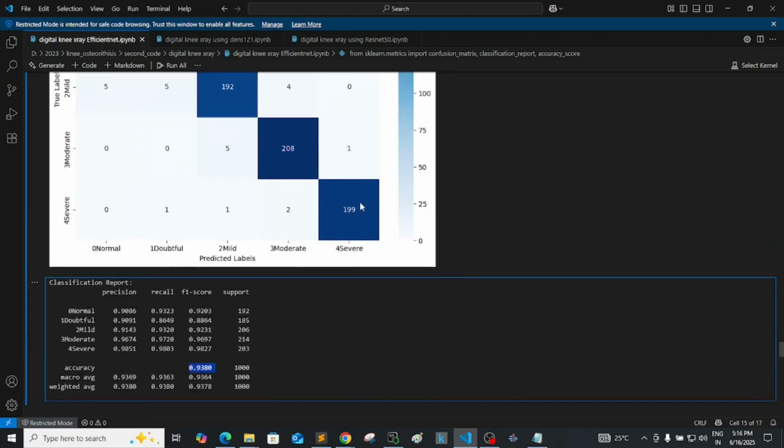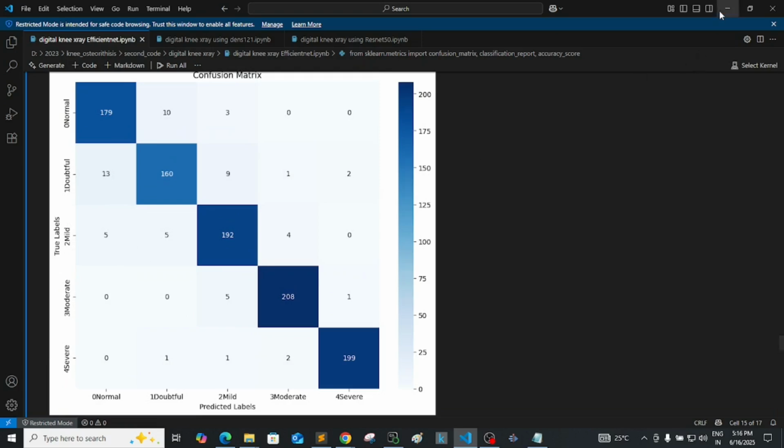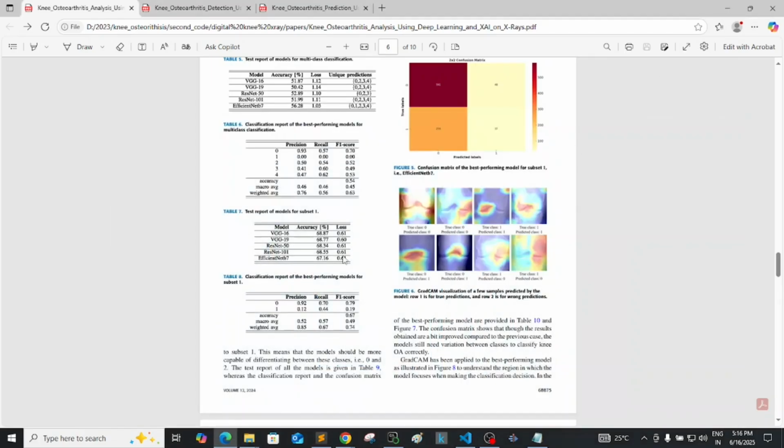We are also using all the 5 classes which that paper is using. So why this sudden reduction in their case? Why are we getting far better results than this paper? What extra are we doing? All those things I will discuss one by one.